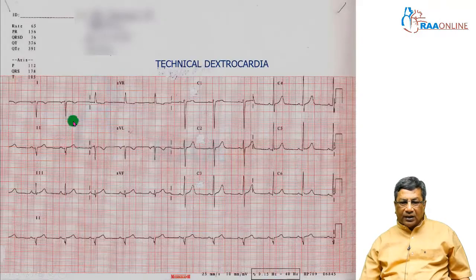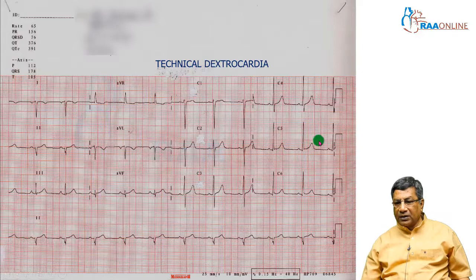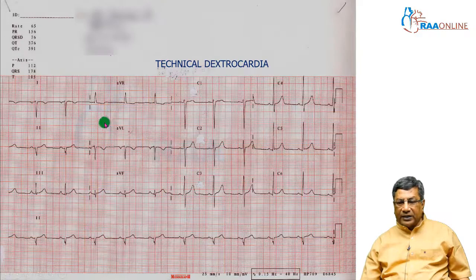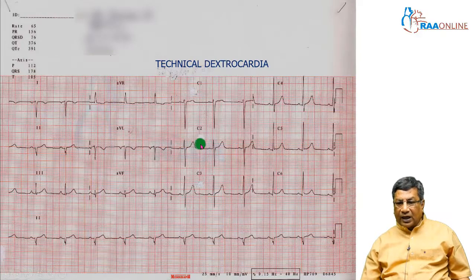Look at this ECG. Here the P wave is inverted in lead I and upright in AVR, but the QRS is progressing normally over the left-sided leads. That means the left heart is on the left side. It is appearing like dextrocardia because of limb lead reversal by the technician — this is called technical dextrocardia. In true dextrocardia, the R wave progresses on the right side. In technical dextrocardia, R wave progresses normally on the left side.